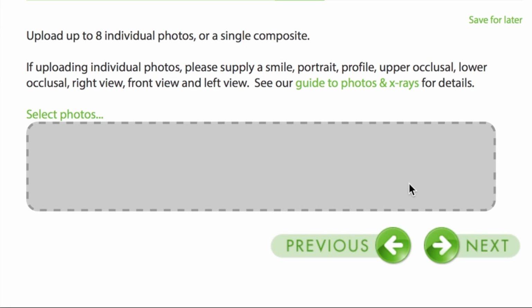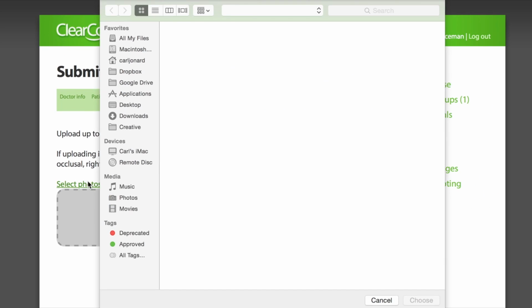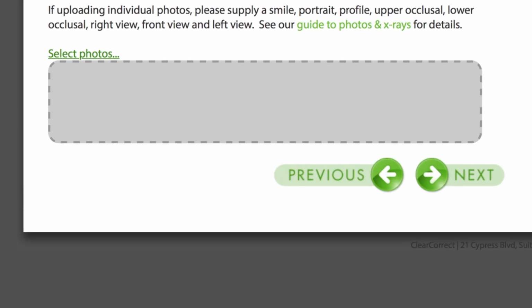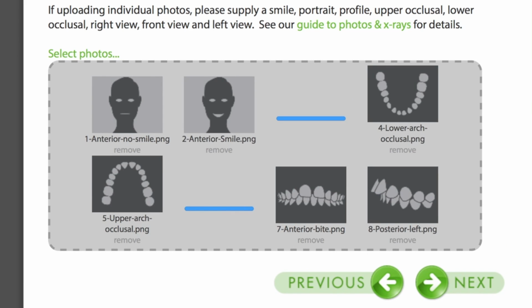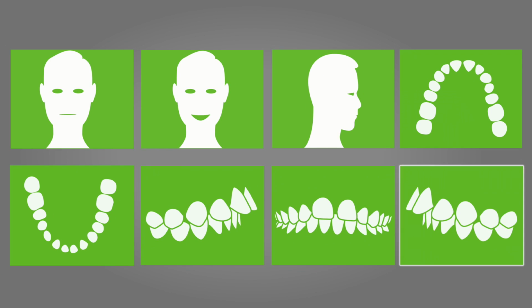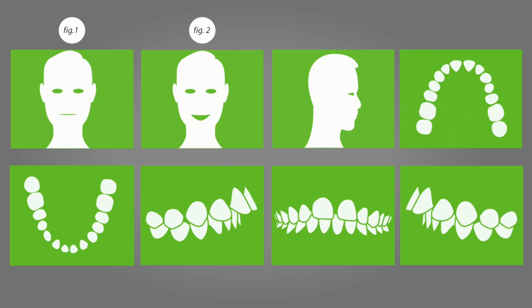Next, it's time to upload your patient's photos. You can drag and drop image files directly into the gray drop zone, or you can click Select Photos to open a file selection dialog. You can select multiple images and click Choose or Open to upload them all at once. We require 3 headshots: a frontal view of your patient's entire face at rest, the same angle with your patient smiling, and a profile with no smile.